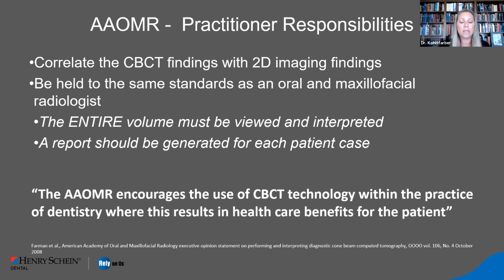And again, you're not alone in this. If you have any questions, there's a host of oral maxillofacial radiologists that are happy to help you. What does it mean by a report should be generated? Well, basically it means you need to put something in the notes.